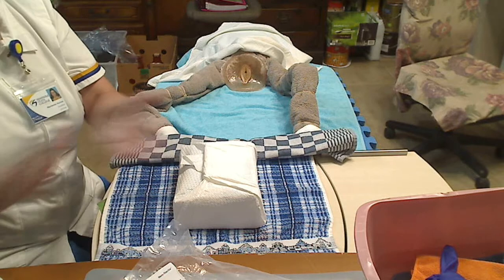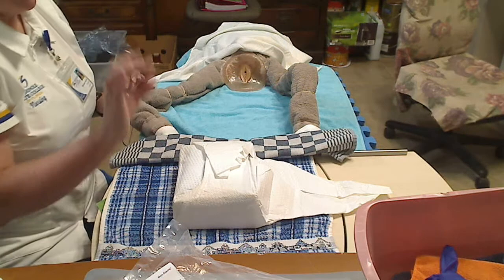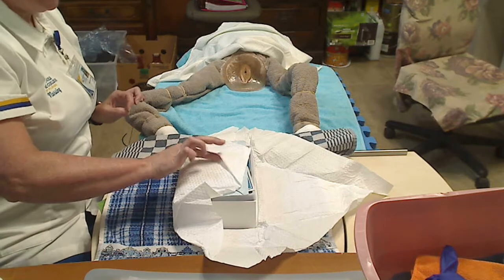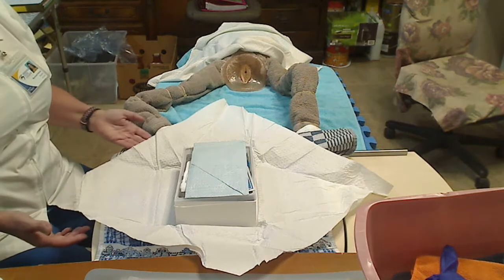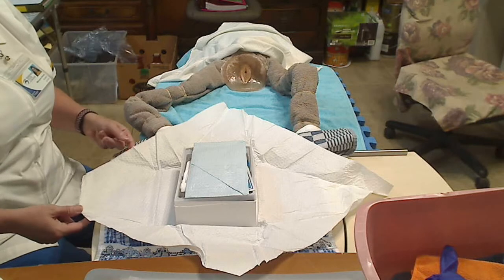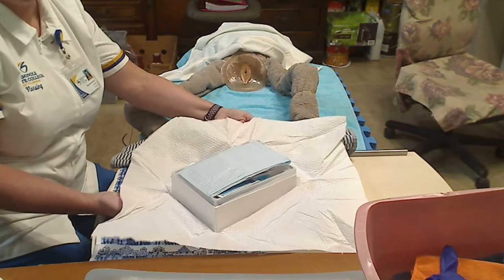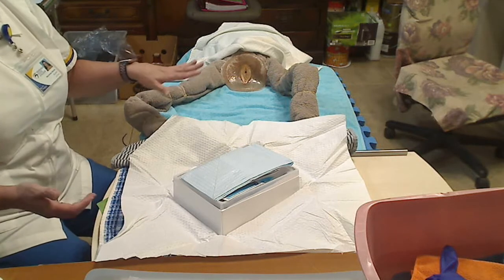Again, I sanitized. I'm going to open and push away. I'm going to open to the sides. And then I am going to use the flap only and bring it towards me. So as not to break sterility, the outer 1 inch is not sterile, but I still am going to try my best not to touch that. I am going to reach underneath and turn this so that it's more of a square. That way it doesn't block as much of the sterile field that I'm going to end up creating here.